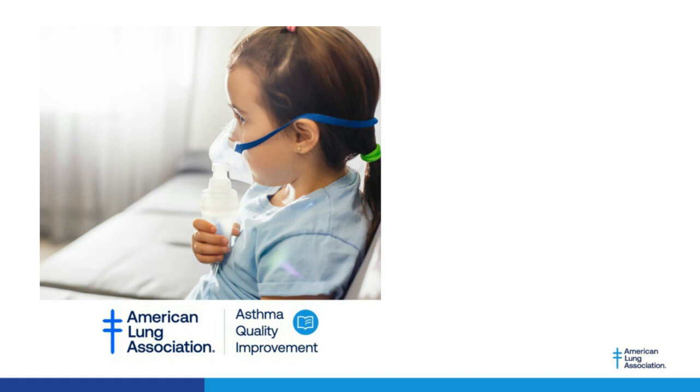These devices are like $100 to $160 or something like that. So I would say that we wouldn't want to use screening type spirometers, where you take a big breath, put it in your mouth and blow hard, during a pandemic, because there's no way to filter the air going through it.